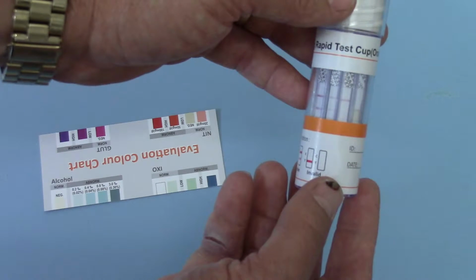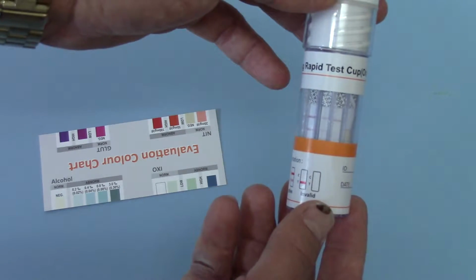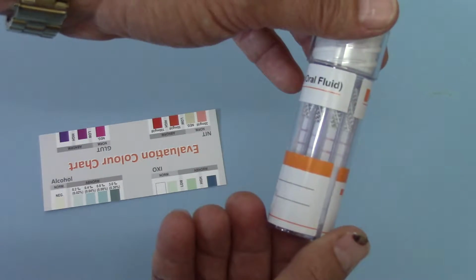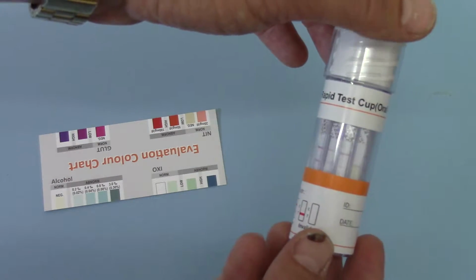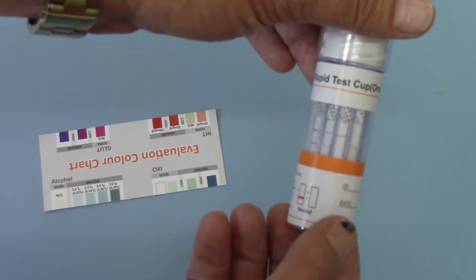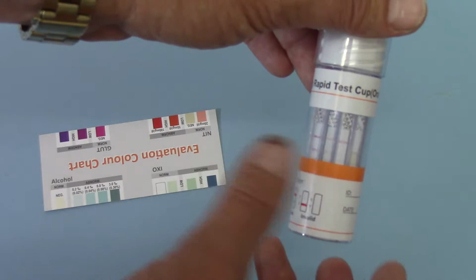That's perhaps the thinnest and faintest on this, but one must remember that the nature of these tests is that they are screening at completely different nanogram levels for drug detection, and depending on the sample that's put in there, you will see some variance from test to test, and certainly from membrane to membrane.